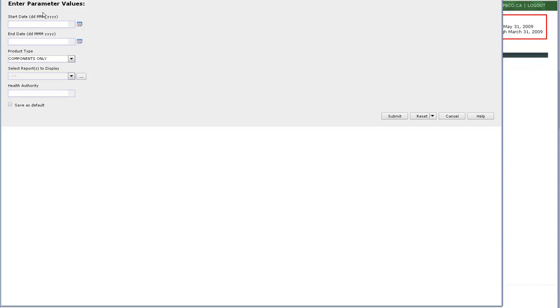In this case, instead of a drop-down for the date selection, we have the opportunity to enter a specific date or select it from a calendar. If you wish to type the date in, be sure that the date is in this exact format. So for example, 01 January 2007. You'll see that the text is red until I click off of that and the text turns black. That means that the system has validated the text format and understands what date I'm looking for.